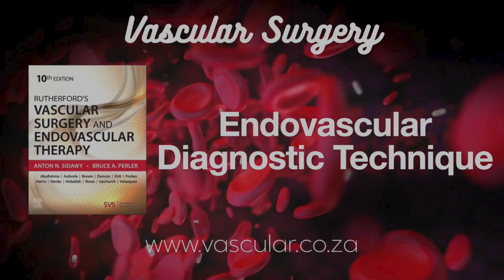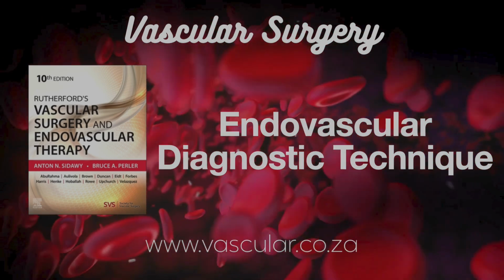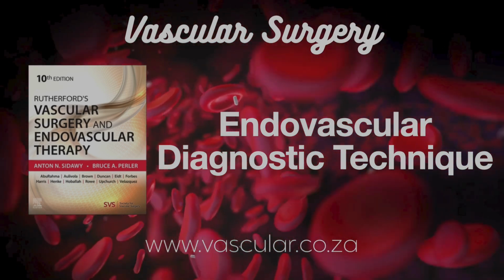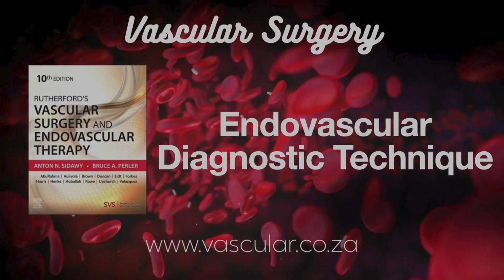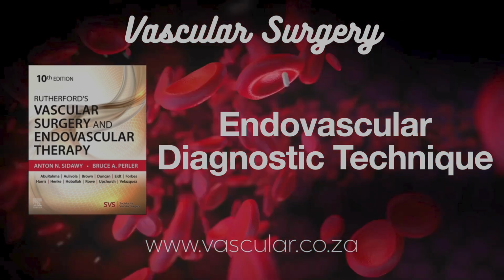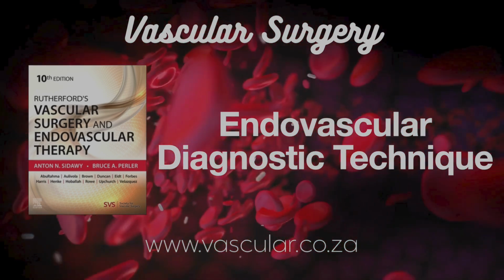Or if there's significant disease upstream affecting the pulse. So what else helps? Fluoroscopy. Fluoro, the live X-ray, is helpful for relating the needle to the bony anatomy, especially in the groin, confirming you're aiming at the femoral head level, avoiding that dangerous high puncture. It's like an X-ray landmark check.